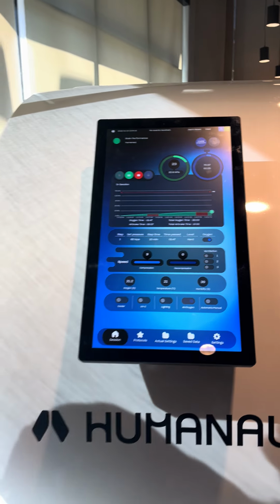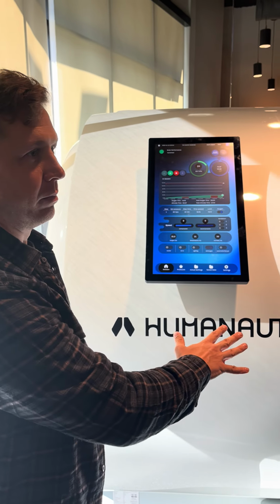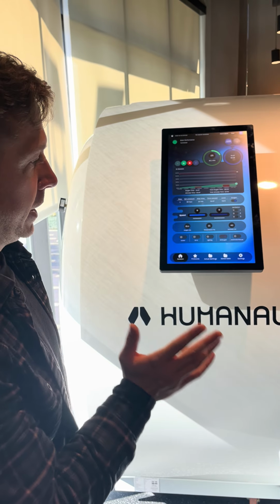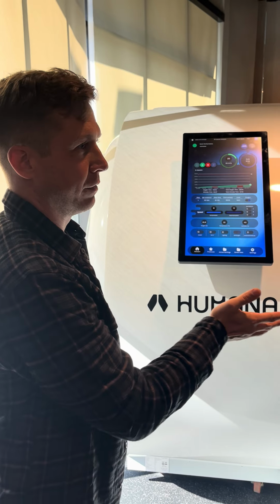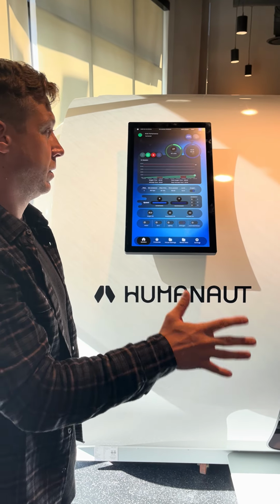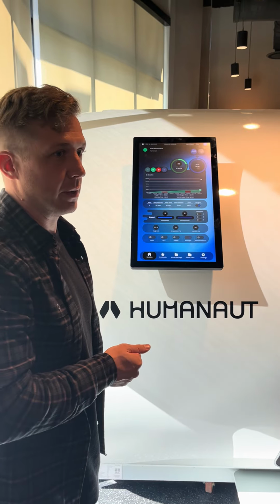Safety checks once every 10 minutes, but during compression and decompression, you definitely want to be here at the controls. It's not a good idea to really stare at them, but you do want to have a visual reference so you can see their face. But then again, you know your clients, you know they're going to be okay. You don't have to stand there and look at them the whole time.